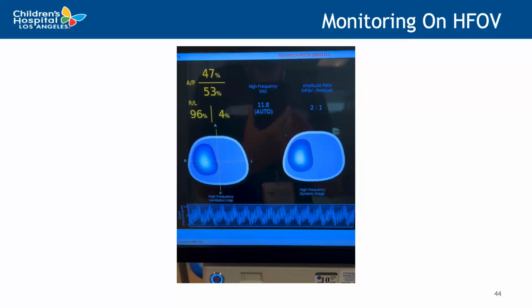And if we started to see areas that were getting lighter in color, it was maybe a signal that this patient was becoming overdistended. We should investigate that further. And so I'm really excited about the next steps for this feature. And again, this is still in research and development.